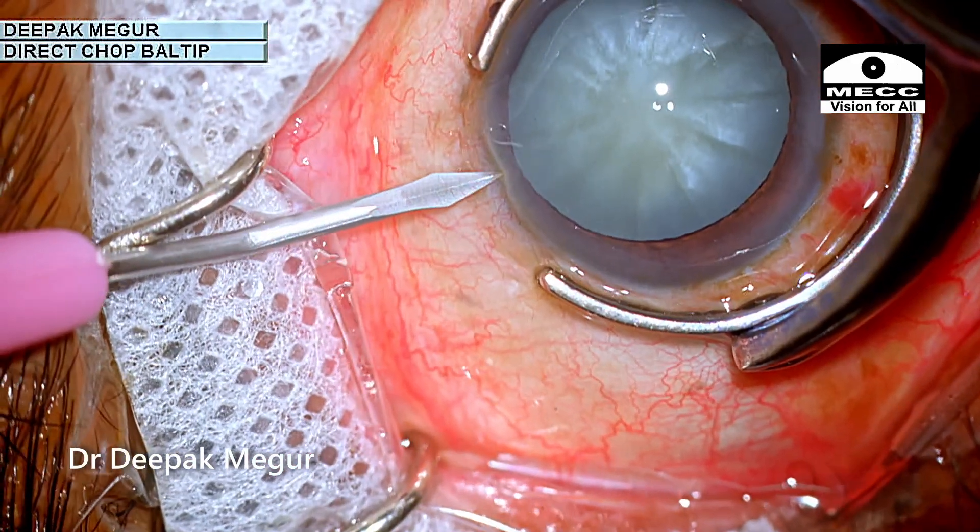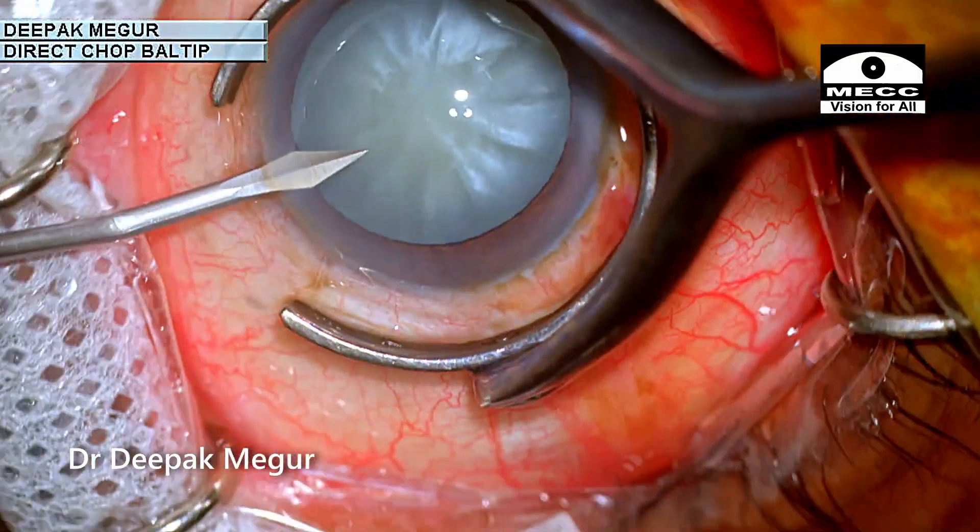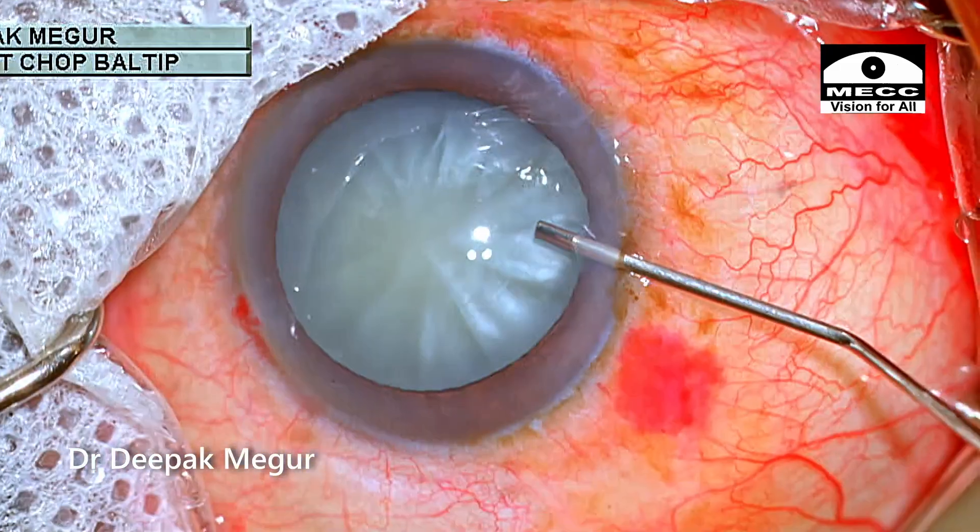The patient keeps jerking his eyes a lot as the surgery is begun. But over a period of time, I am hopeful that he settles down well.